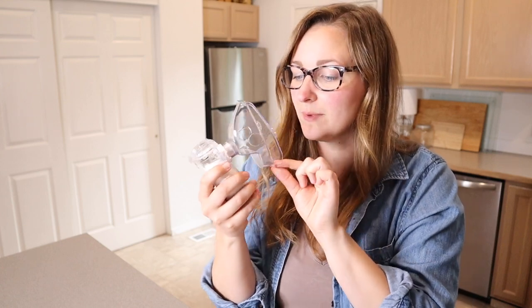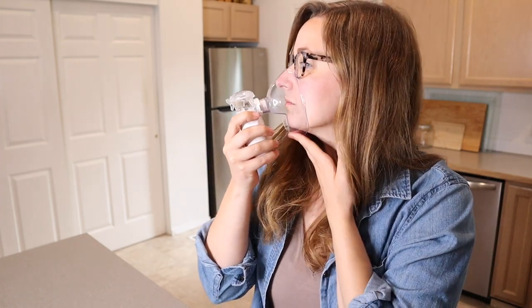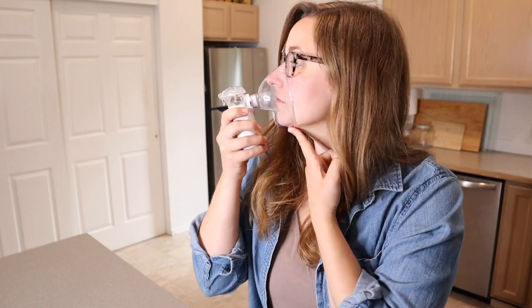You can see I'm just going to place it on my face — it's going to cover both my nose and my mouth down to my chin, and you can just fit it so that it's nice and snug. Then you're just going to go ahead and turn it on to use it.